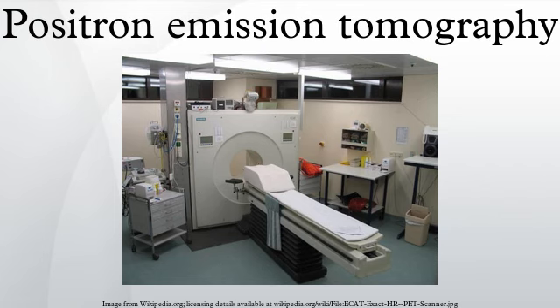This limitation restricts clinical PET primarily to the use of tracers labeled with fluorine-18, which has a half-life of 110 minutes and can be transported a reasonable distance before use, or to rubidium-82 with a half-life of 1.27 minutes, which is created in a portable generator and is used for myocardial perfusion studies. Nevertheless, in recent years a few on-site cyclotrons with integrated shielding and hot labs have begun to accompany PET units to remote hospitals.